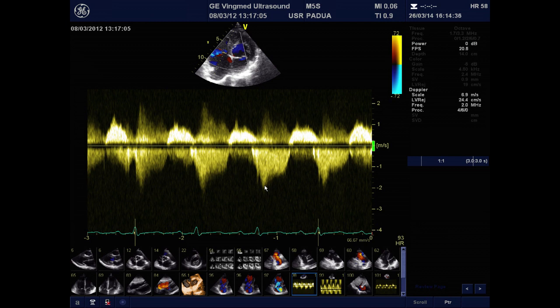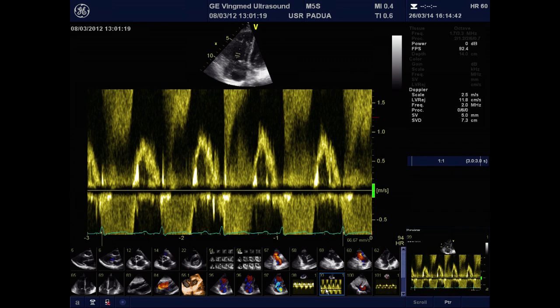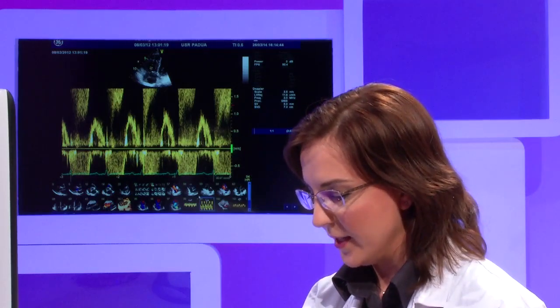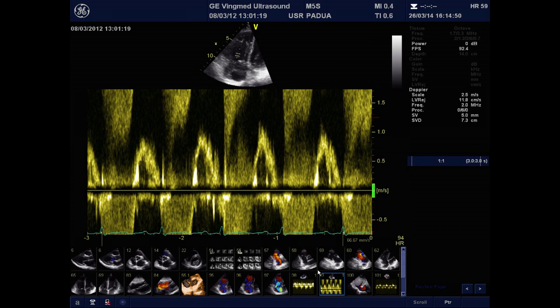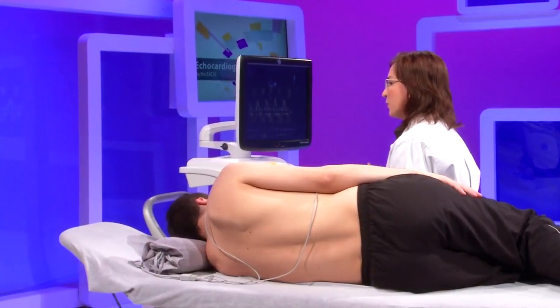And this, together with the pulsed Doppler wave profile, which in case of our patient has this aspect with E and A waves fused, you can see that the velocity of the fused waves is somewhere around 1 meter per second. Again, the antegrade velocity of the E wave is increasing in proportion with the severity of the tricuspid regurgitation. So the larger the severity, the higher the E wave velocity. And the cutoff for severity is 1 meter per second.